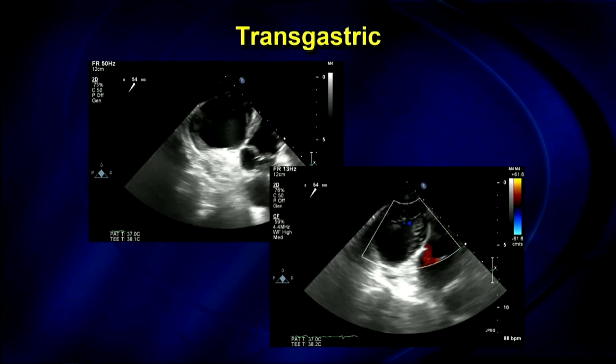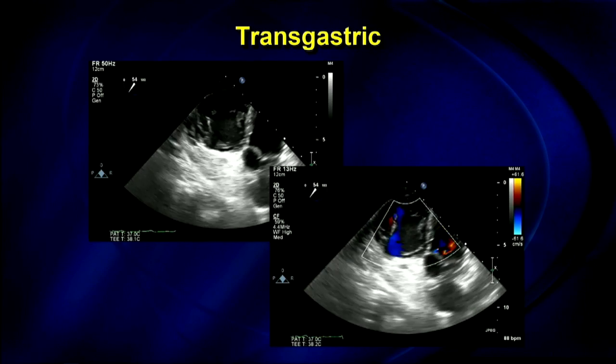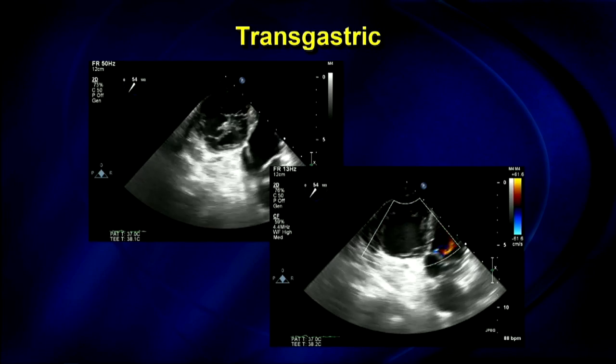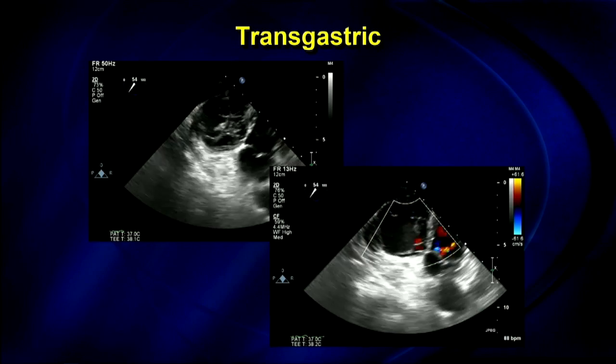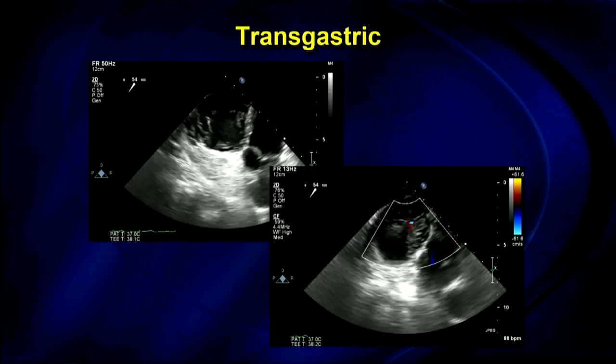Here you can see this transgastric short axis view of the tricuspid valve. This has been really instrumental to TriClip procedures. You can see the leaflet anatomy quite well with a lot of detail. You can see where the regurgitation is coming from. But this isn't an easy view to get. You have to have a little patience.